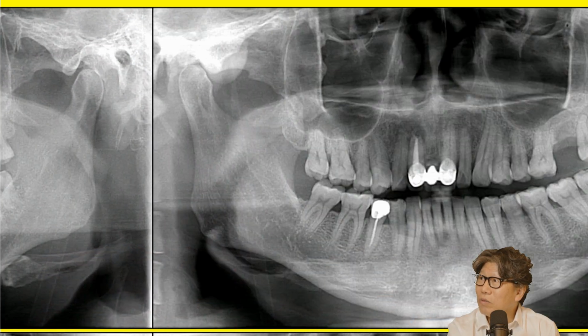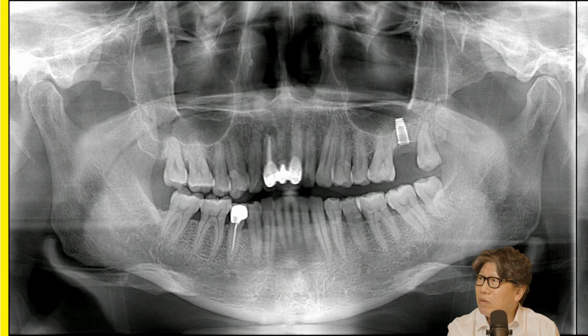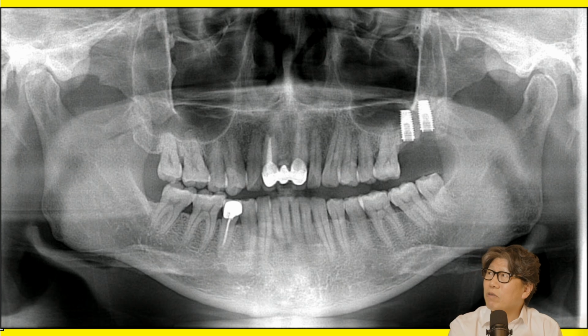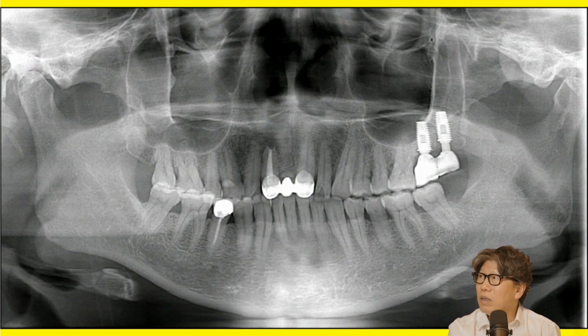And then you look at all these other cases, and I planted it, it fell out again, and I planted it again. I think it's because of number 7, number 8. So I said, let's take out number 8 and re-implant it. And I did it for free. So that's how I've been using it for almost 15 years now. He's an employee of this town hall, so I know him very well. I took out number 8 antagonist teeth. It was occlusal, eventually. So this went on for a long time.